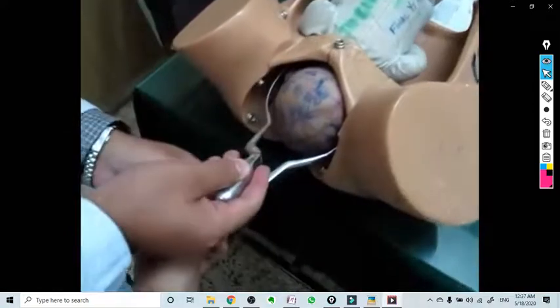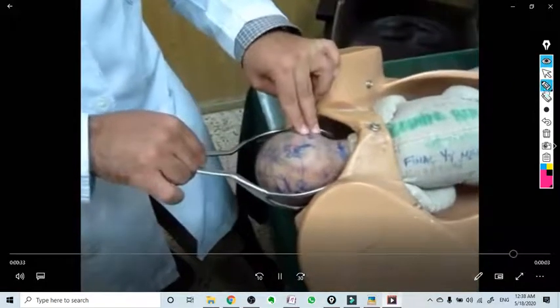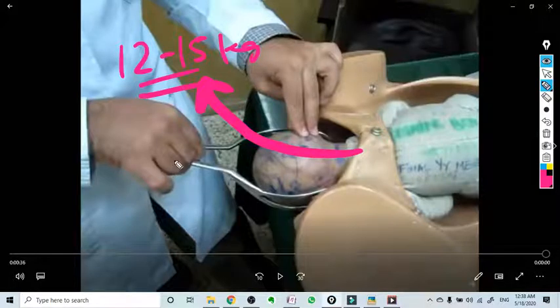Now you just lock and give traction in this direction. Maximum traction should be 12 to 15 kg. You can practice this by lifting a weight of 12 to 15 kg — not more than this weight should ever be applied. Thank you.